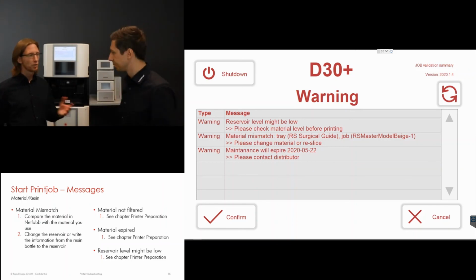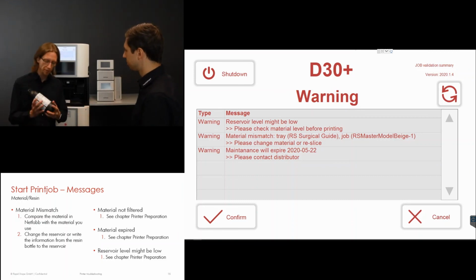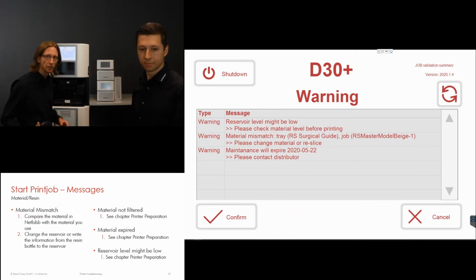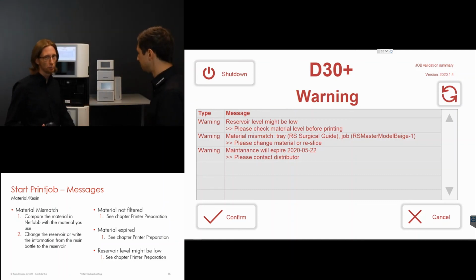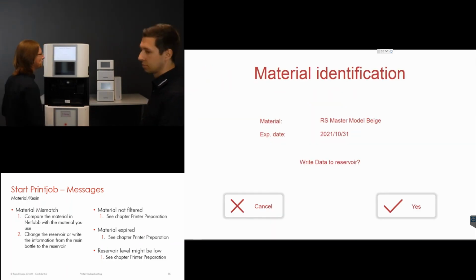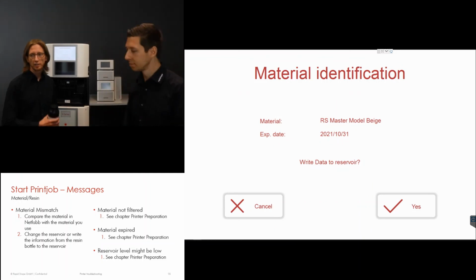So we also explained this in previous webinars. We have the RFID tag on the bottle. What we have to do is put it in the position where the RFID sticker can be found in the machine, which is at the bottom right. So I just hold it right next to the machine, and let's see what happens here. Beautiful. Good. So we get the information.